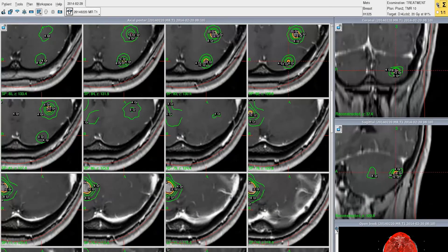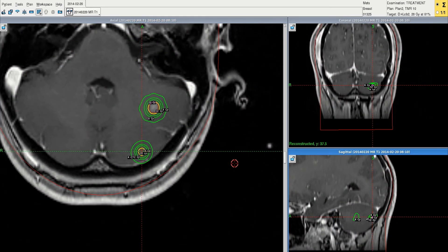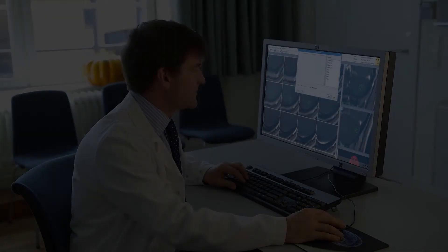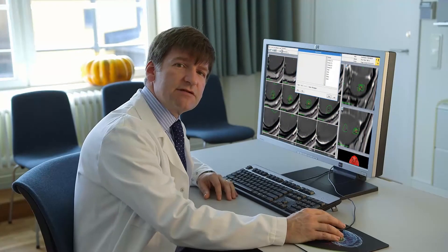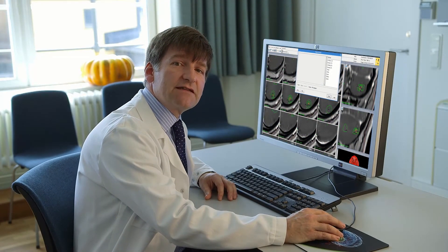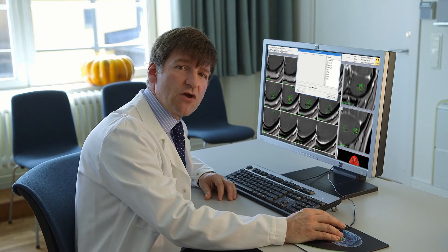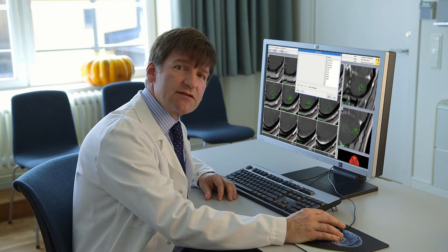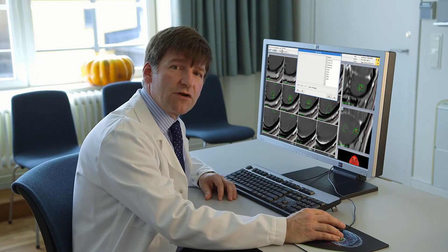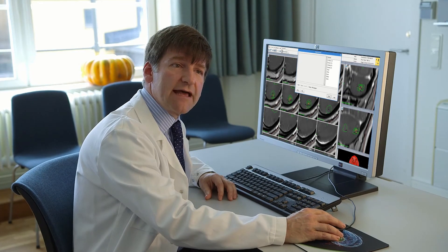Lexel Gammaplan automatically compensates to take into account dose contributions from other targets. Some assume that if you treat multiple targets with the Gamma Knife you're effectively giving whole brain radiation treatment. We can check this by performing volume and dose volume histogram measurements for the whole head.